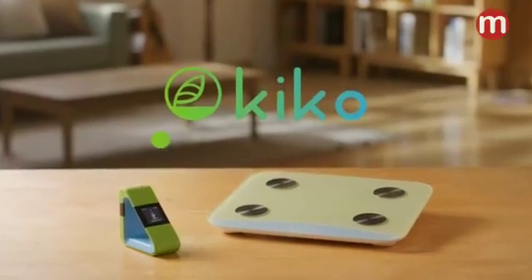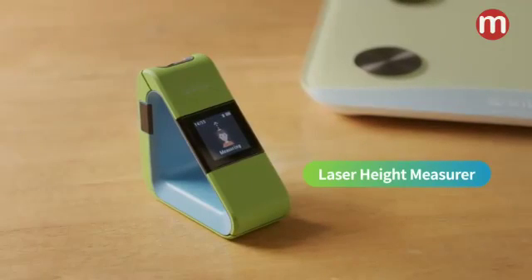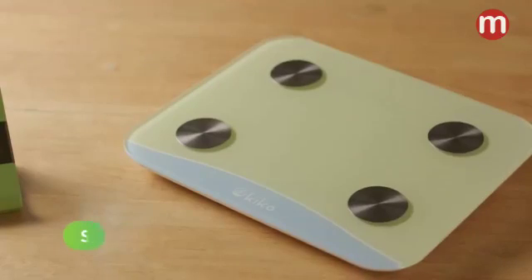Say hello to Kiko, the world's first laser height measurer and smart scale. Measure your child's height and weight with ease and accuracy at home.